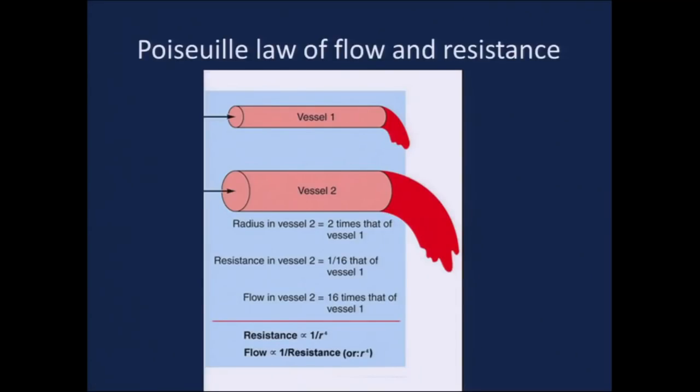Just to go back to physics to explain why this infant, in spite of passing the contrast down the rectum, then developed signs of obstruction. Remember that the contrast is just 10 ml. And this infant was kept NPO for 2 or 3 days before the contrast, so his intestine was empty. So the narrow part of the intestine was able to pass a small amount of contrast. But if you are giving feeding, overfeeding, you are accumulating the intestine.